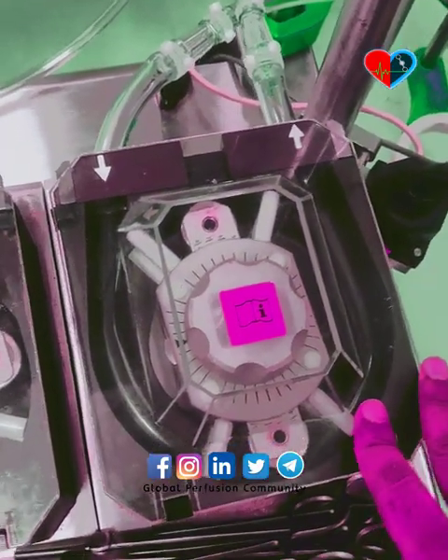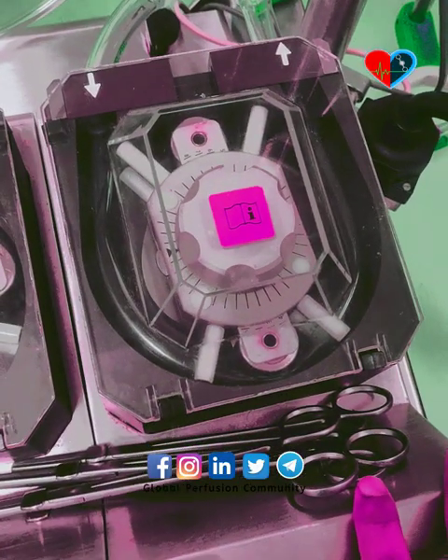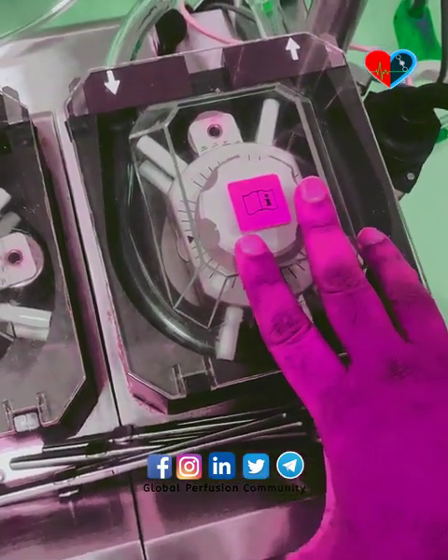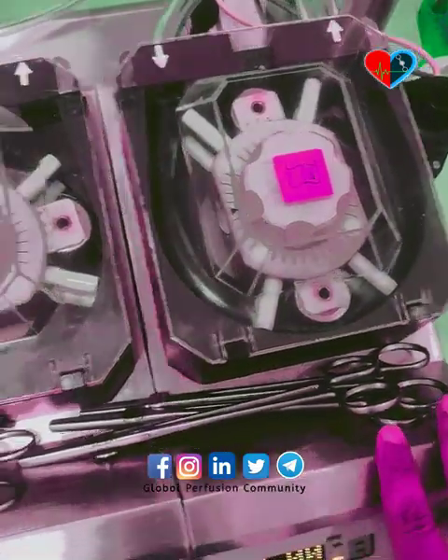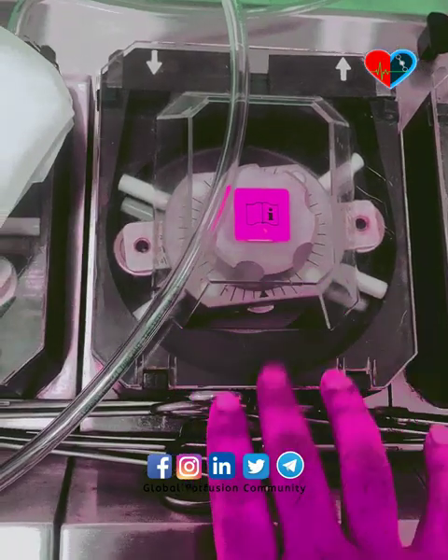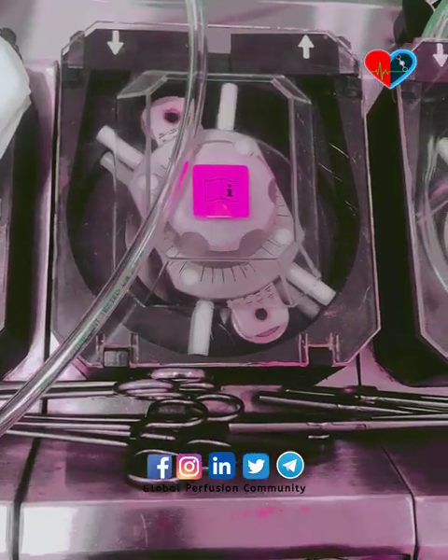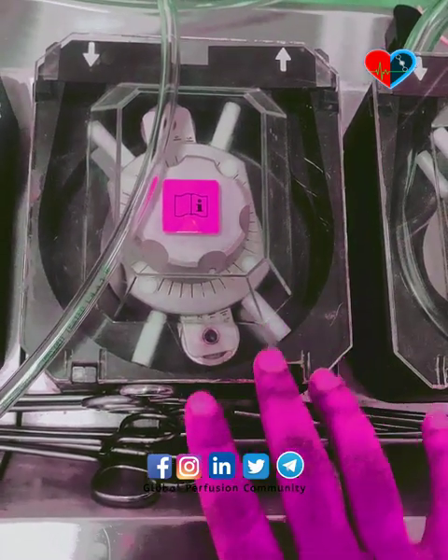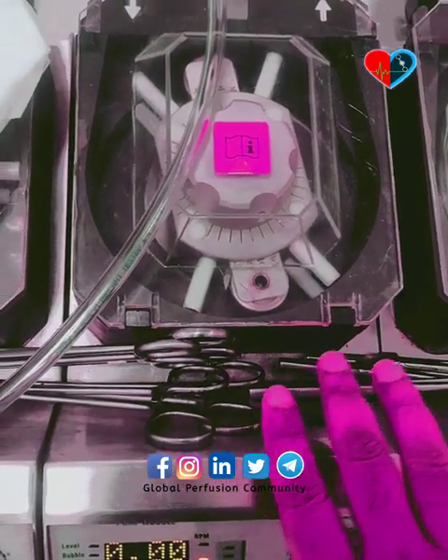This is the main pump — the arterial pump. This pump does the work of the heart; the main pumping work is done through this pump. This is the cardioplegia pump, and the purpose of this pump is to deliver cardioplegia.